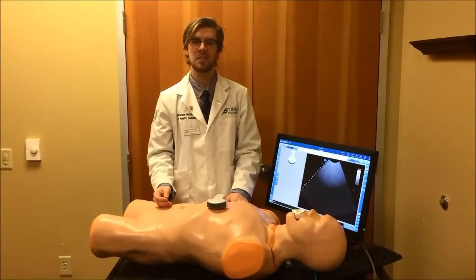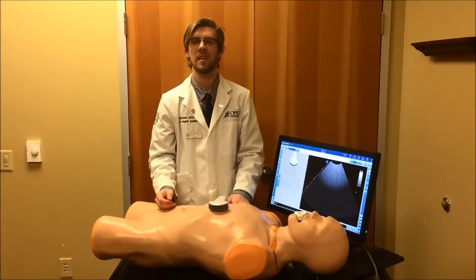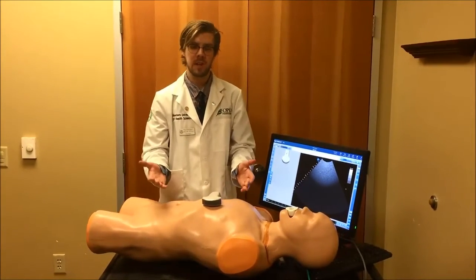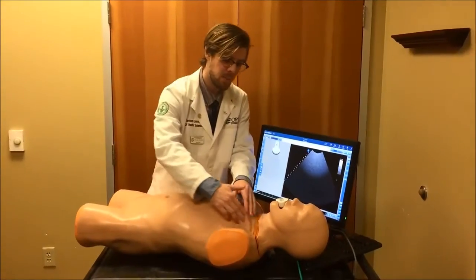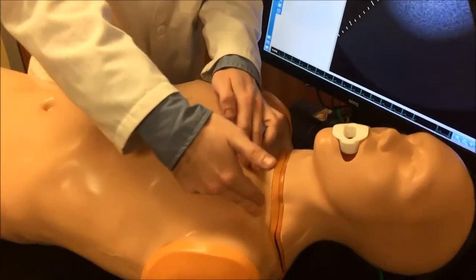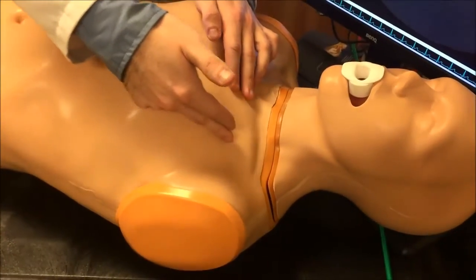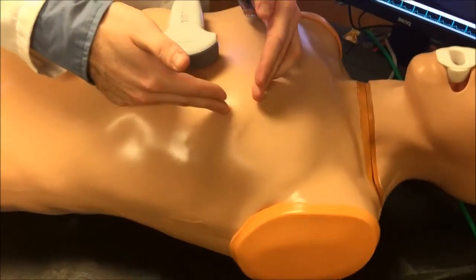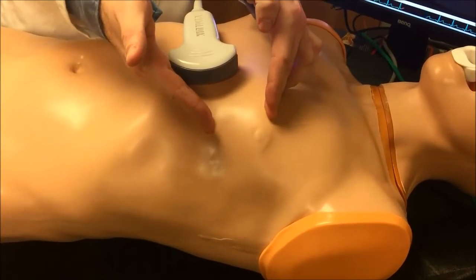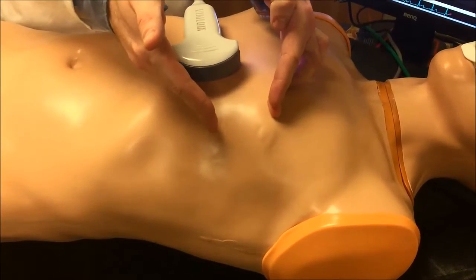Hi, I'm student Dr. Dylan Roper, and I will be demonstrating the long and short axis parasternal view. The first thing we will do is palpate our patient's left clavicle and find the midclavicular line. We will then drop down to about the 3rd to 5th intercostal space. We will call this the parasternal window.